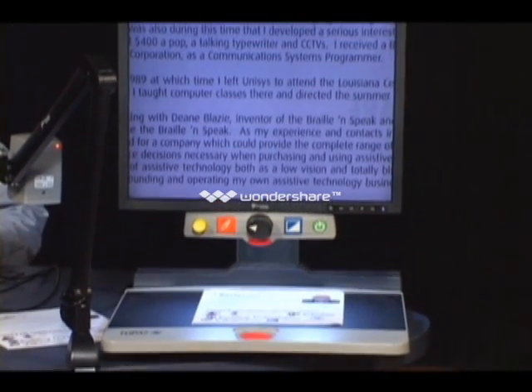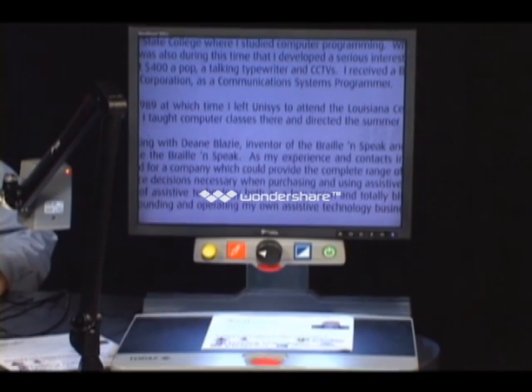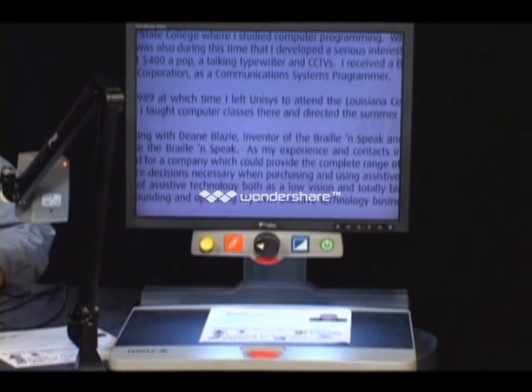It doesn't matter as much with a brochure like we have today, but it does matter if you're looking at the New York telephone book or something large that's pretty heavy. It gets pretty difficult to slide that around without some help. And so this table is on bearings. It lets you move it comfortably from left to right, up and down, and you can also lock it.